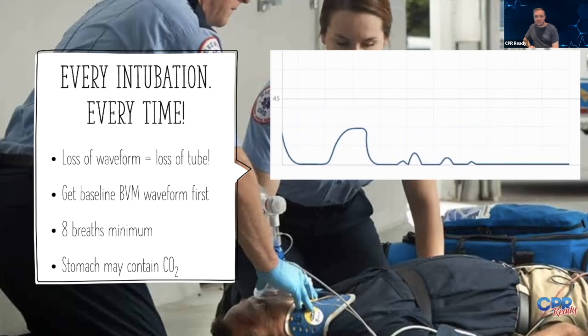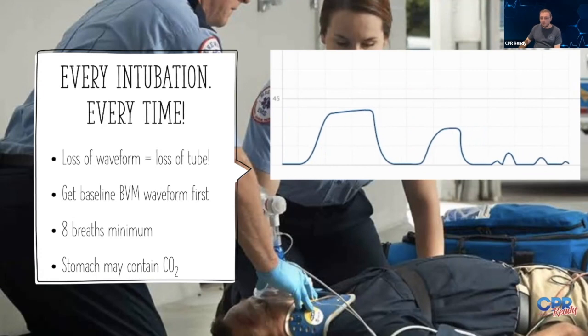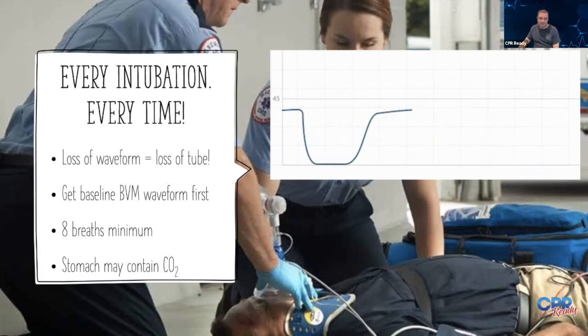Whether it's an ET tube, a King airway, an iGel, you should be able to hook this up to your monitor. Just remember, if they're in a low perfusion state, it's good if you can monitor this before you intubate them so you get a good baseline, but you should still have a present waveform. If you lose that waveform, you've got to reassess that tube, and you've got to assume that it's come out. It may have been the best intubation you've ever done, and you swear you saw it go through the cords, and you know it's there, and the lung sounded good, but things happen. Things get dislodged. Never, ever, ever show up at a hospital with an esophageal intubation. There's just no excuse for it.